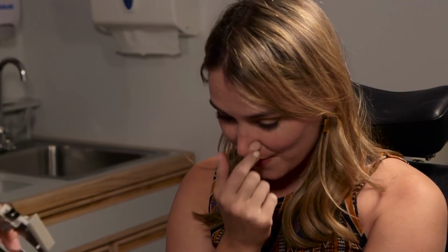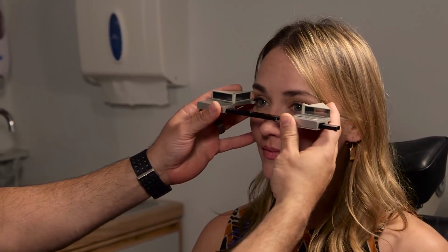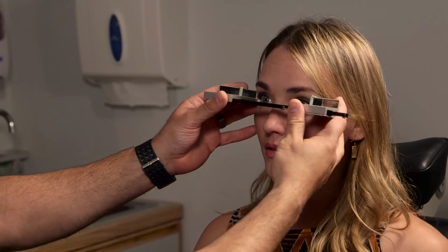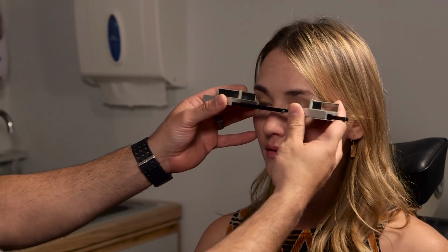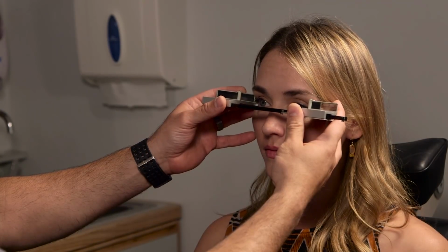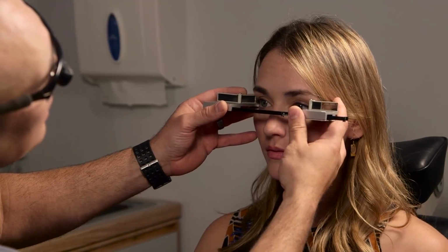If they'll tolerate, I'll have them do it for up to 20 seconds. I have my exophthalmometer ready to go and have them look straight ahead. I'm going to put it right back and I'm going to look at the eye that I'm worried about first. Okay, and look straight ahead. I want the center of that cornea right on the line, making sure I'm parallel to the floor. Good. Okay, and there's no increase in proptosis or change in the measurement, so you're doing great.